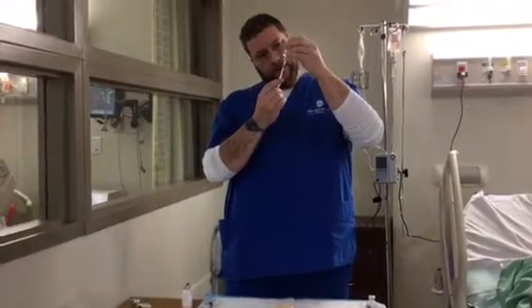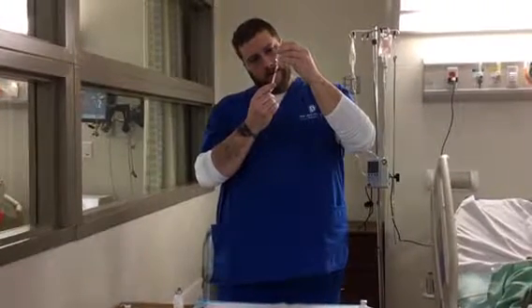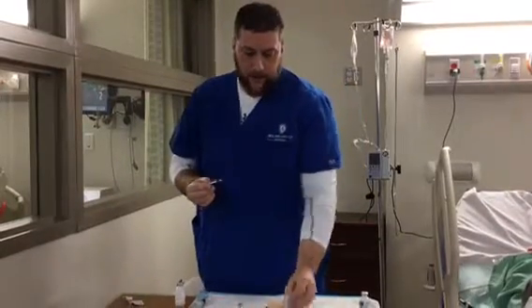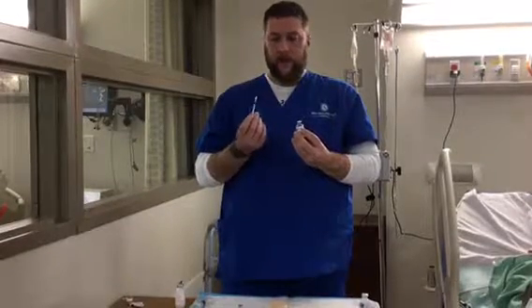Making sure that there's no air. At this point, if you're a little bit off and you do have air, you can expel it since the medication is not yet mixed. So I'm a little over 10, so I'm going to go to 10. Now I would do the cloudy. Once the cloudy is withdrawn, you cannot redo it. If you go over or under, you need to start over again.